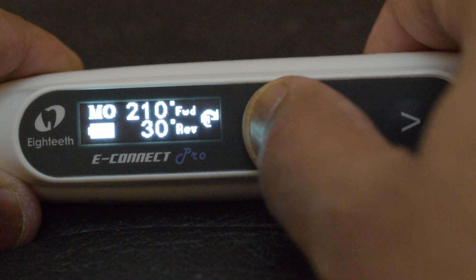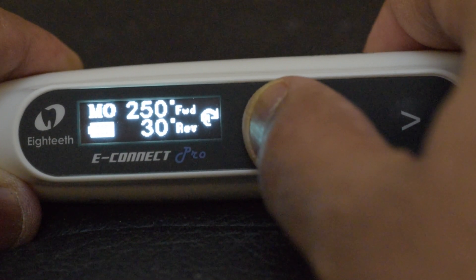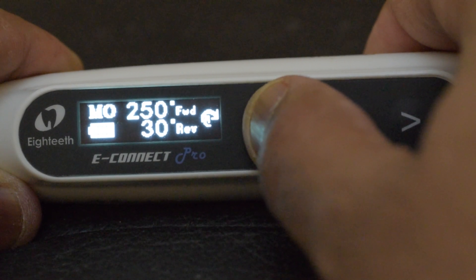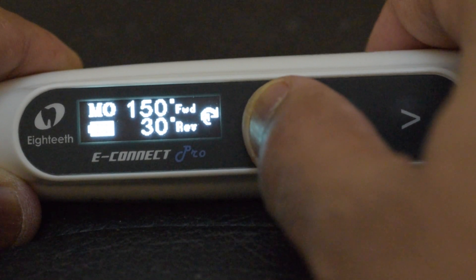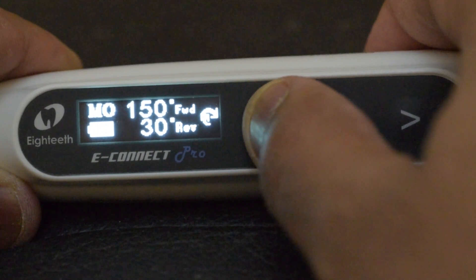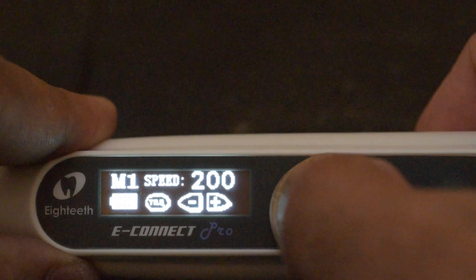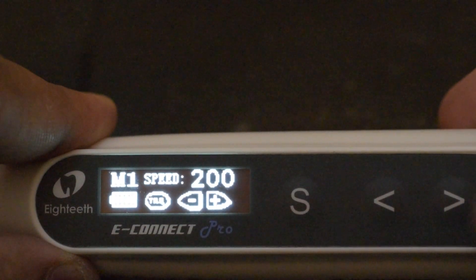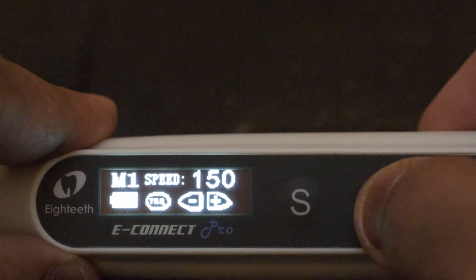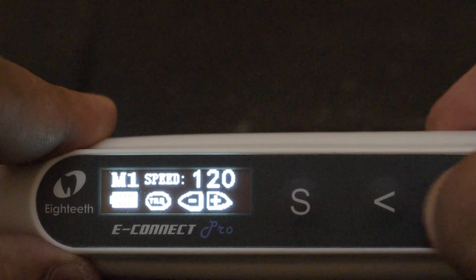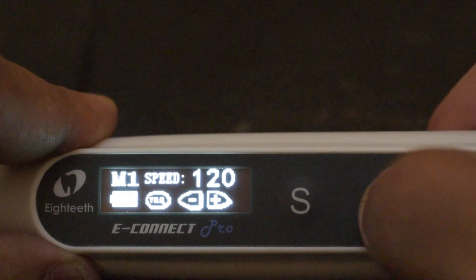Keep watching and I will show you the difference between reciprocating mode and the continuous mode. In the rest of the modes, that is from M1 to M6, you can change the speed, torque, and the direction of revolution.